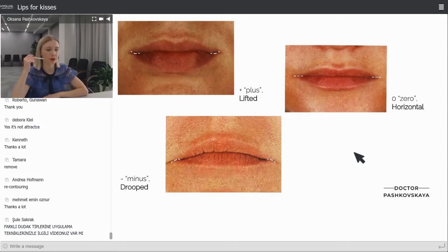I will show you now, but before I show, I just want to explain. You inject the upper corner, maybe a few millimeters under the upper, make an injection, and you go through the commissure line into the lower lip. Then on reverse, when you come back, you put a little amount of filler, and then don't go through the skin, but reverse and go to the upper lip and do the same.